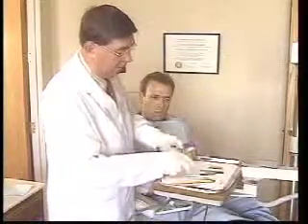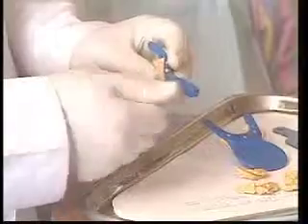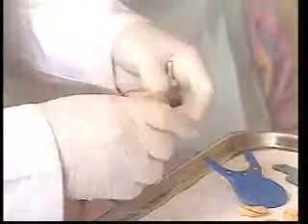Now cut out the impression putty from the heels of both clutches. Be sure to expose all the holes. Rethread the stylus with pin end down. Mix more putty and place the material in the heel ends. We're ready to go back to the mouth.